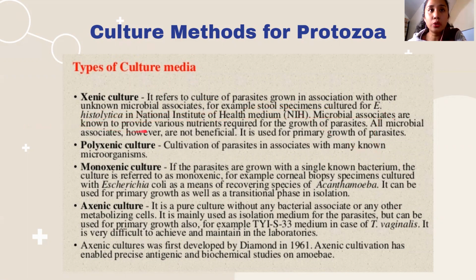Microbial associates are known to provide various nutrients required for the growth of parasites. All microbial associates, however, are not beneficial. It is used for the primary growth of parasite. When we say xenic culture, it has other live microbial elements inside that culture. So, it is not pure.